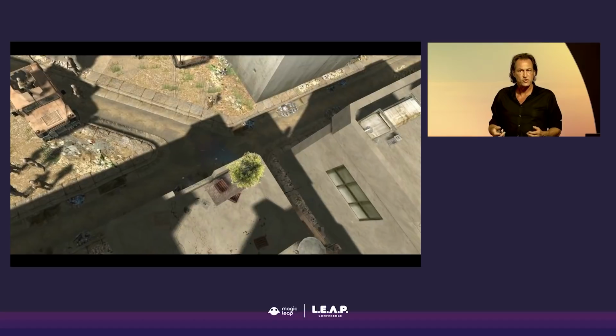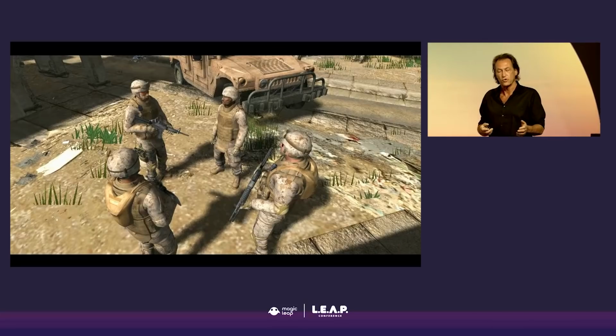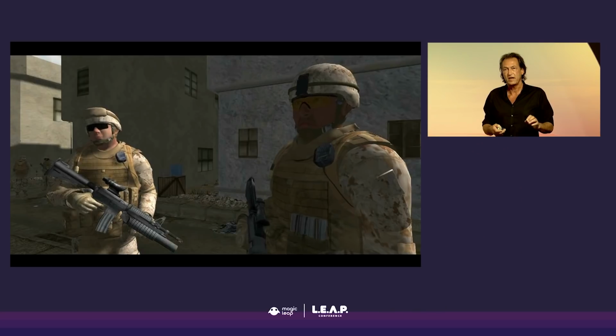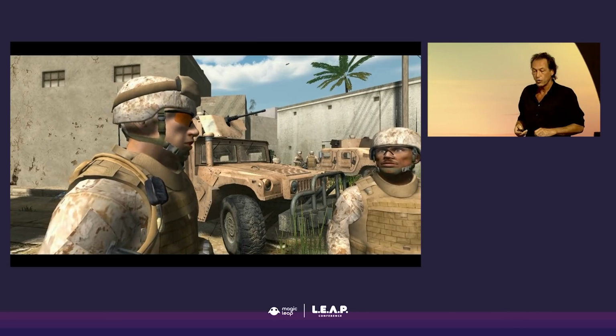So in the psychological domain, this is one of a series of simulations we developed for treating PTSD in service members from Iraq and Afghanistan. It's an evidence-based approach where you help a patient to confront and process difficult emotional memories in a safe environment. There's some already existing data that's supported, but a new study is coming out that's really going to hammer that point home soon.